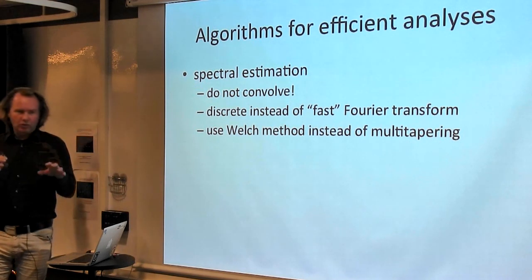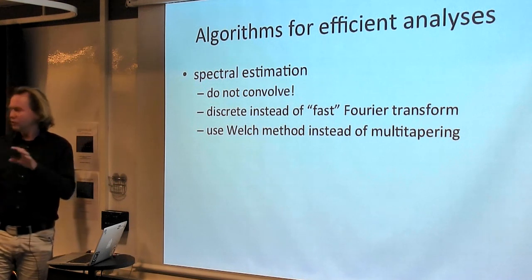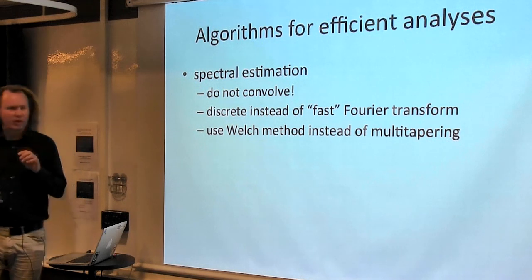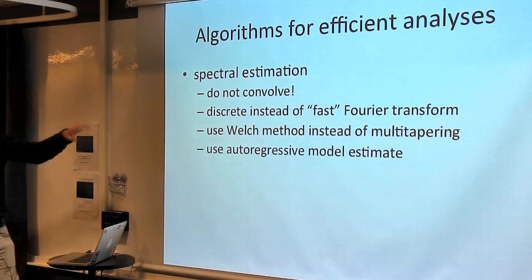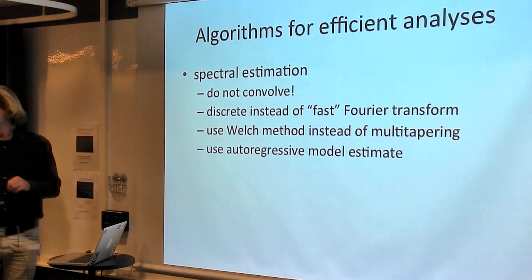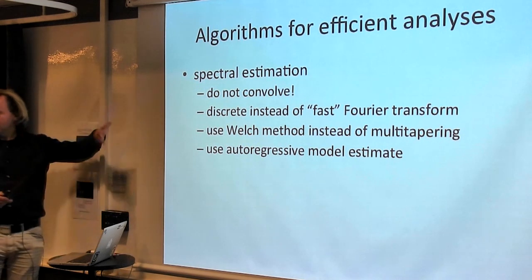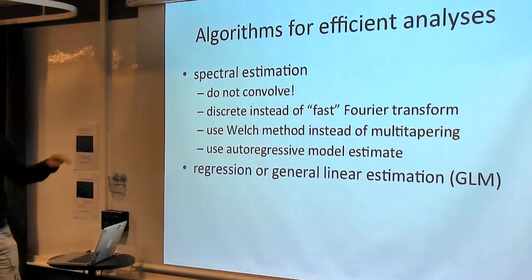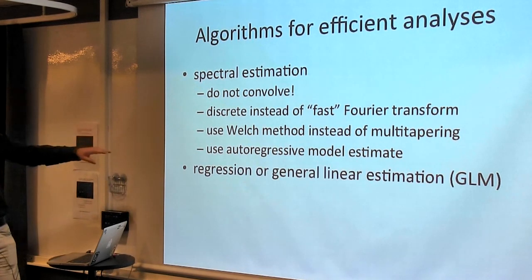properly tuned as a multi-tapered spectral estimate, but still you can implement smoothing with the Welch method, and it's computationally much faster. Even faster is to use autoregressive models. Just some ideas to get you started with making things run really fast.